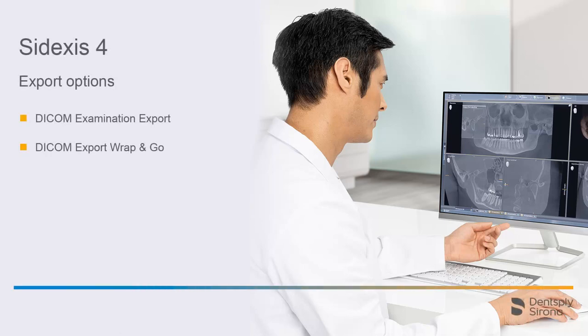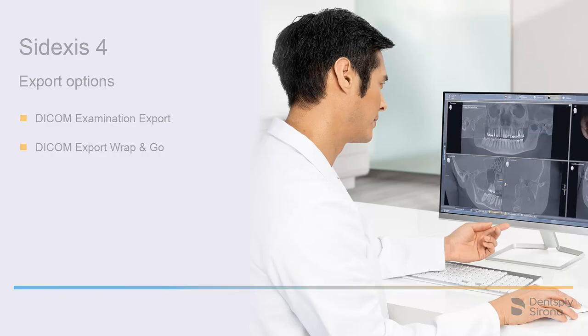Welcome to this video tutorial on the topic of export options with the Sidexis 4 software. In this video, we will focus on two options: DICOM Examination Export and DICOM Export Wrap & Go.